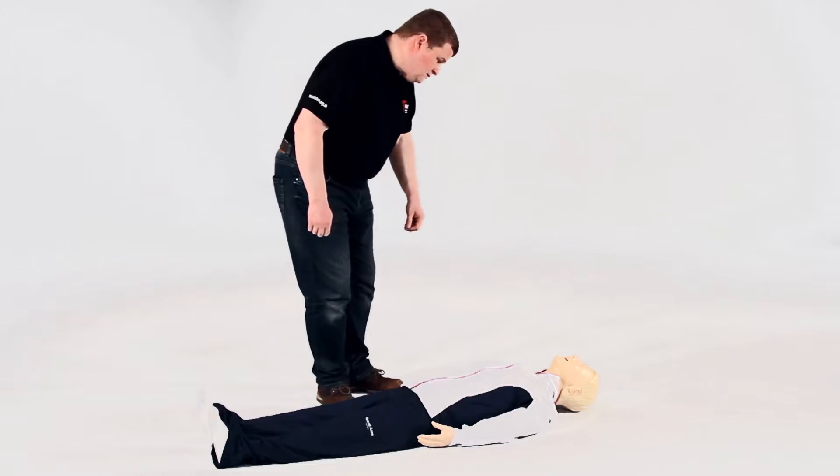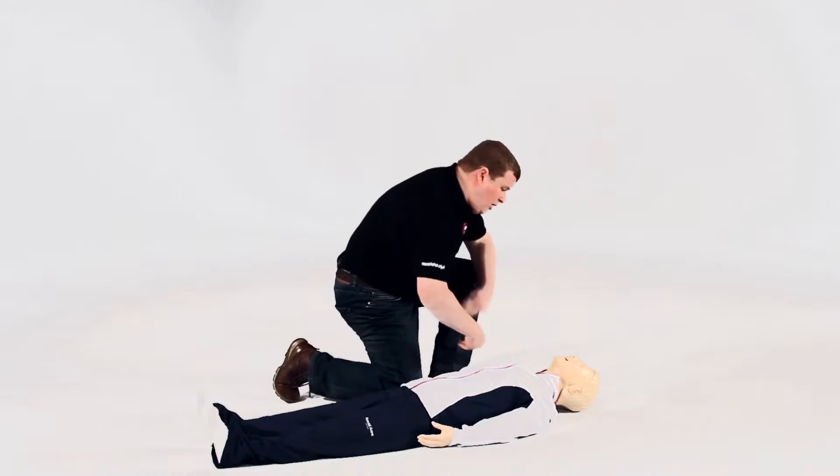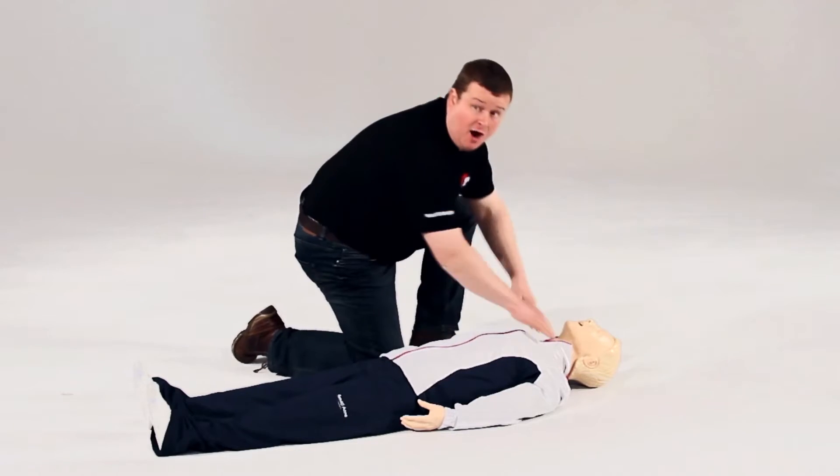Can you hear me? Are you all right? Open your eyes. Can I have some help please?